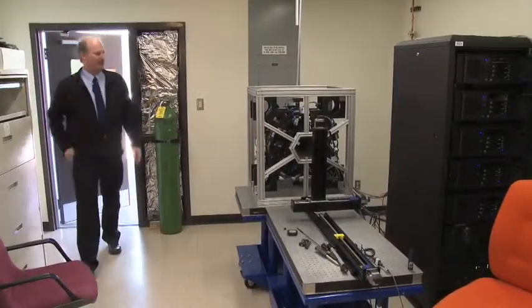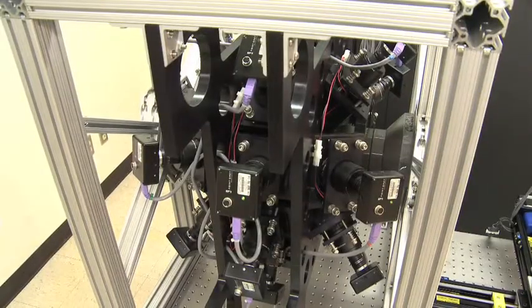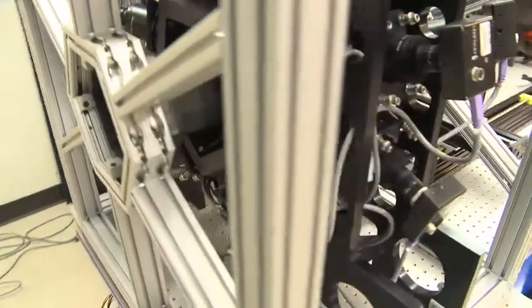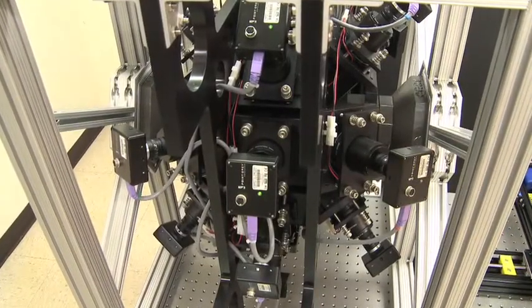In this laboratory is a system that we call Fastpic 3. Fastpic 3 is our latest generation of the Fastpic class of instruments that surround the imaging subject with cameras from all directions in order to be able to capture truly dynamic three-dimensional images. The Fastpic 3 system is a dedicated rodent brain imager.